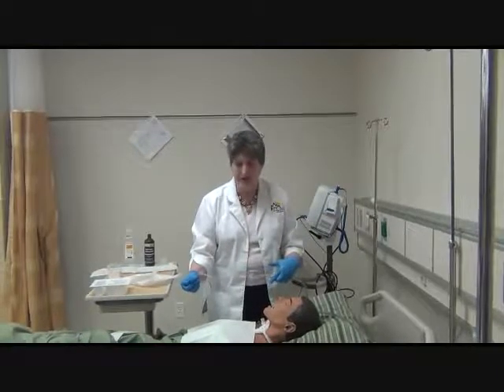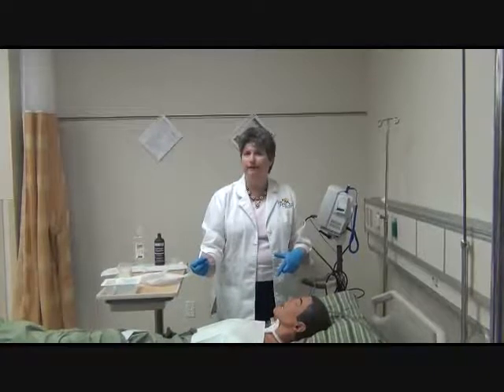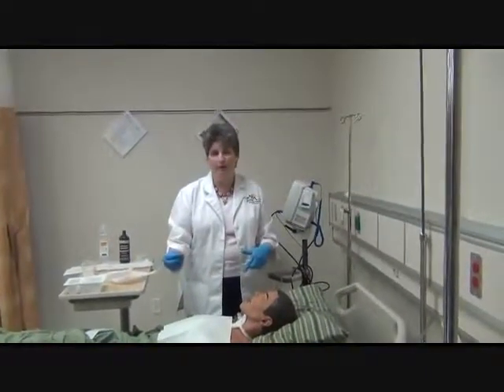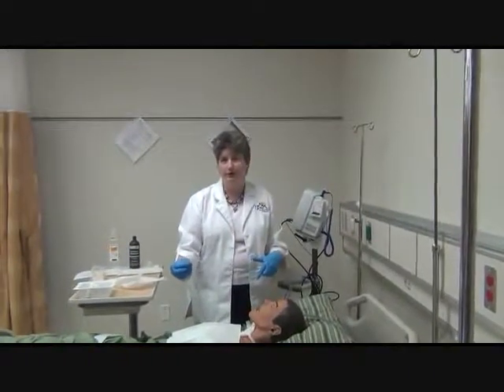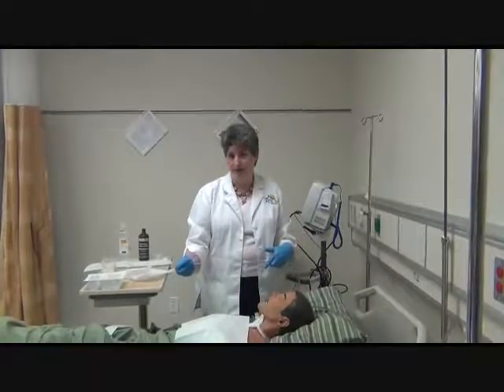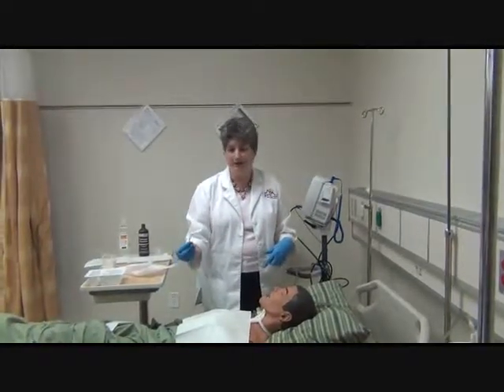If you've suctioned this patient before, you'll know what to have your suction settings at. If they have thicker secretions, it might have to be a little higher, a little lower for the thinner secretions. And you're going to have to just gauge that by what's happening with the patient and how frequent you have to suction. We want as little trauma as possible.